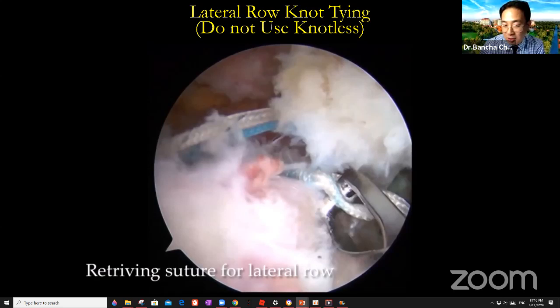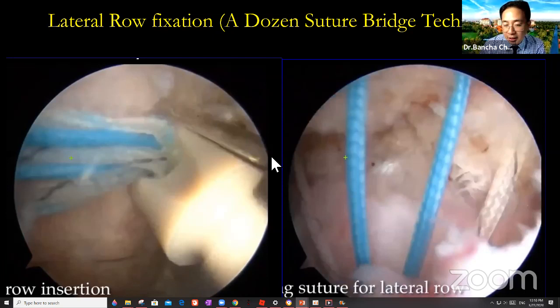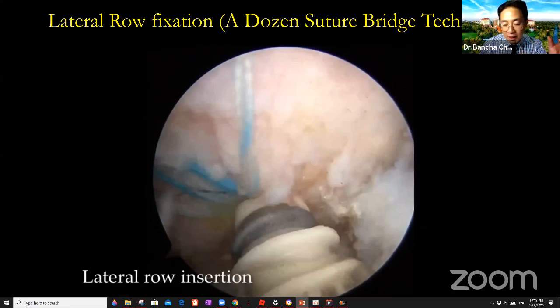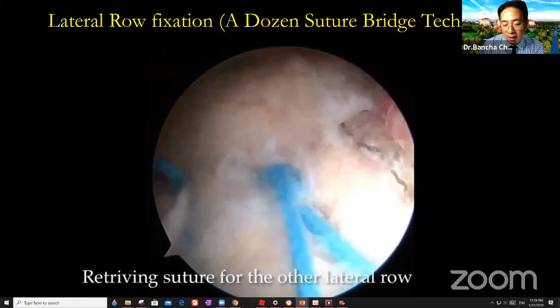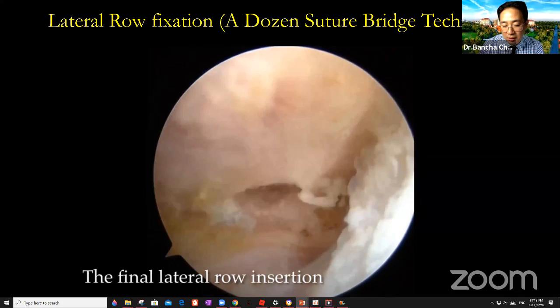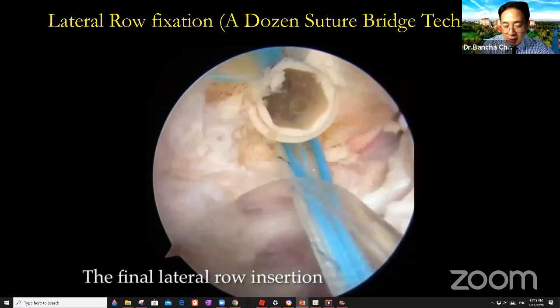And then you take these 12 sutures, separate them in 6 and 6, okay? One in the front, one in the back, okay? And be very careful, you should spread this suture in the very front, very front is close to the biceps groove, okay? And also in the very back, okay? That way. After tie the knot, then you put this in the front, you're going to cross the bicipital groove, okay? Like that way, yes? So you have six and six, okay?